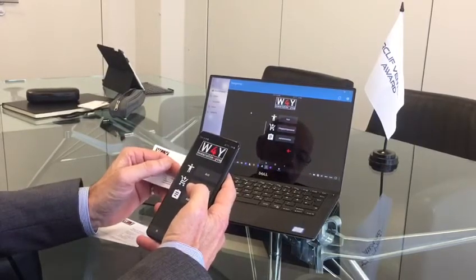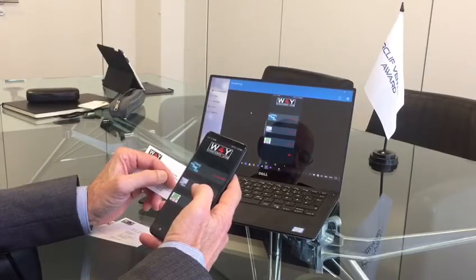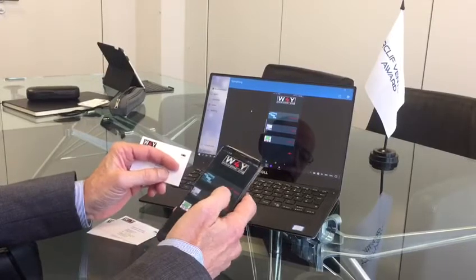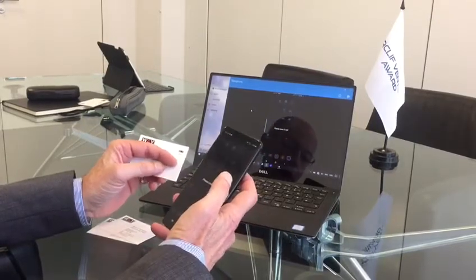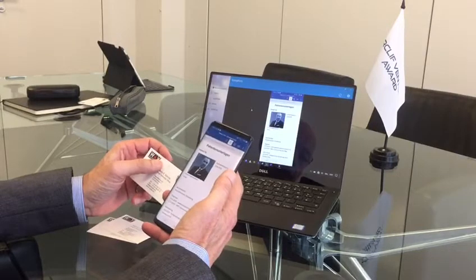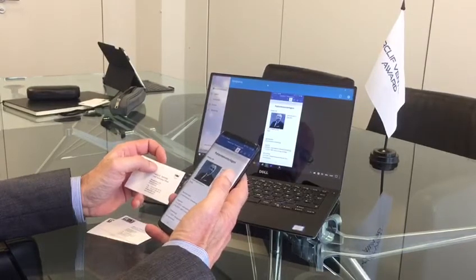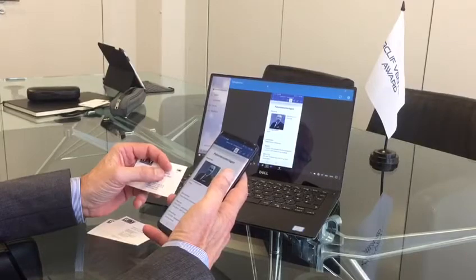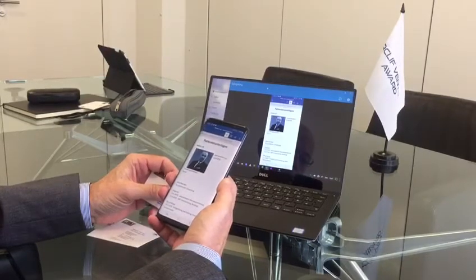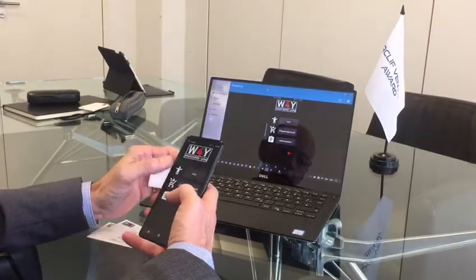We've used what we can do, what the doctor can do. So the doctor can just open the menu, and I've associated this particular tag with one patient. So, for example, the doctor, while he is in the hospital at the patient in the room, can scan the nail of the patient, and immediately, based on this unique combination of the nail, he can see the personal details of the patient. So that's one example. We can go also with another example for the same patient.